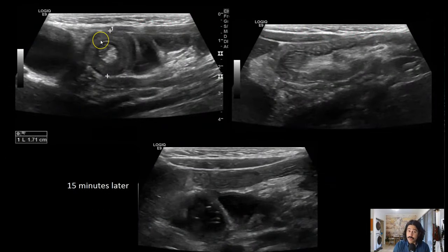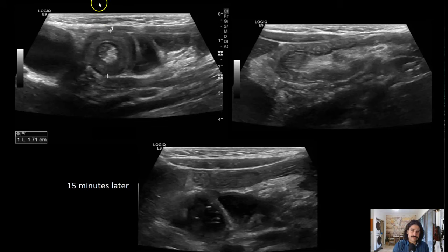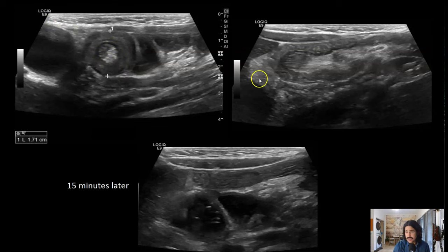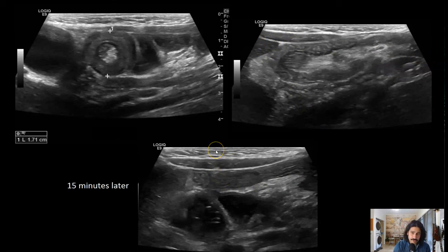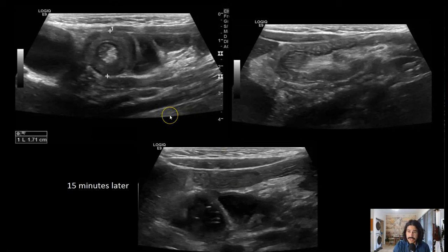Here's another case — a right upper quadrant one, which is a good place for intussusception. But in this case it was not ileocolic — it measures only 1.7 centimeters, tiny bit of mesenteric fat, no lymph nodes, no lesions. Here's the gallbladder. In sagittal it looks pretty big, but 15 minutes later it was gone and the patient wasn't complaining. Small bowel intussusception does not require treatment. When it's found and documented, it unfortunately leads to many more ultrasounds as parents become worried every time their child cries.